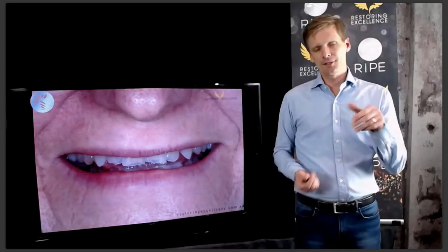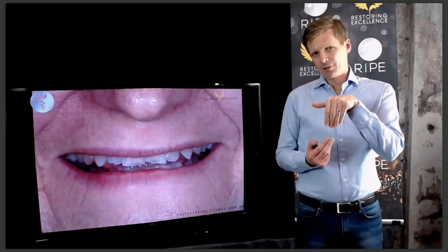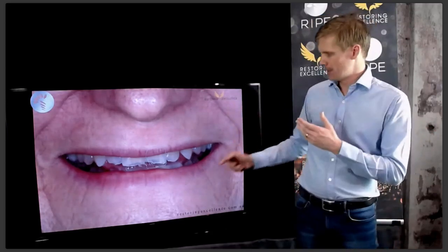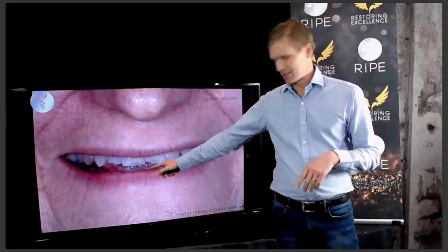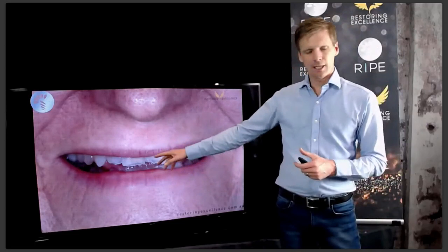Now these patients can be quite difficult because sometimes as you increase the length of the teeth, then they start to smile bigger and then the teeth still look too small. And that actually happened with this case. I measured all of this and I sent impressions and face bows and things to the technician and I said, add exactly 2.7 millimeters to this corner of this tooth, and I gave him all the lengths. If you do these all the way along and you calibrate them, then you can add in exactly all the lengths that the technician needs to add on.